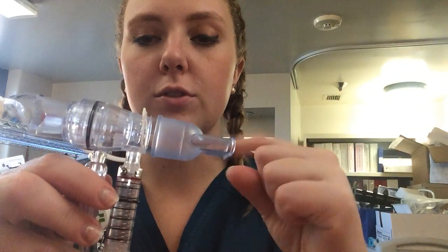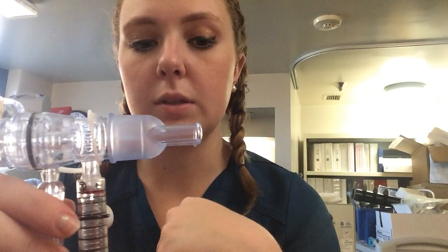I'm going to instruct my patient to put their lips around the mouthpiece here and make a nice tight seal. You can use a nose clip if needed if your patient is having issues breathing through their nose.